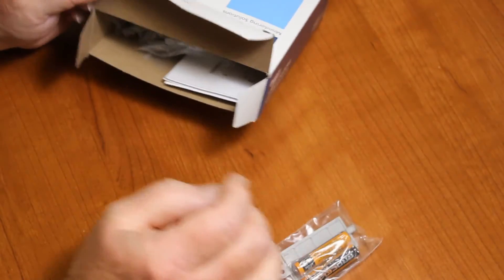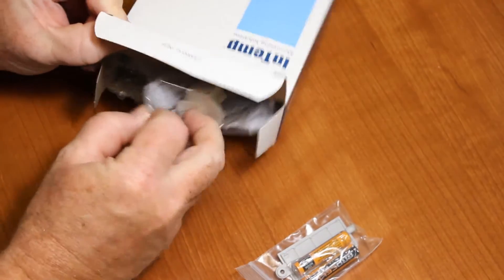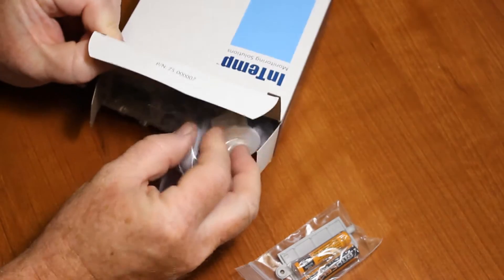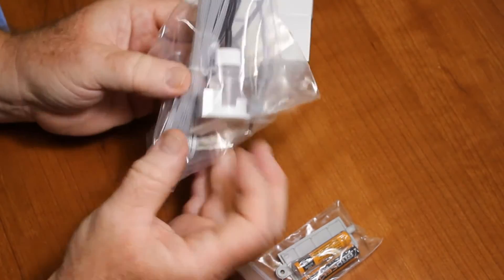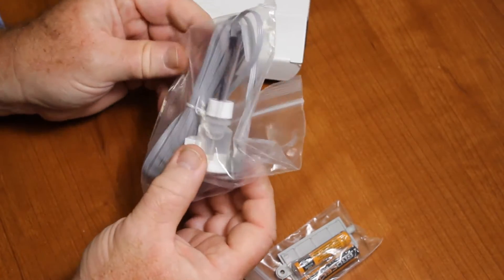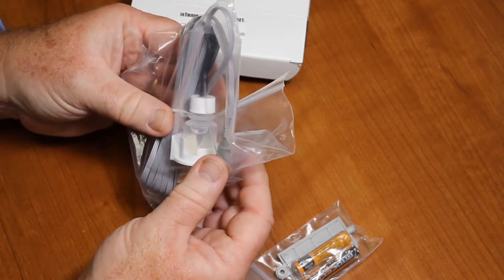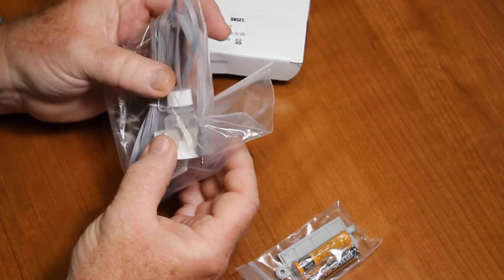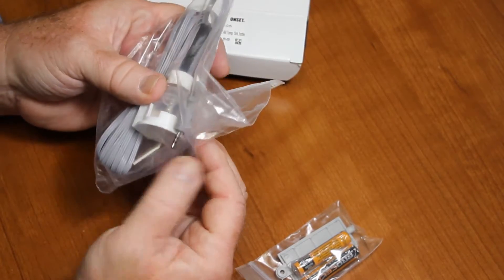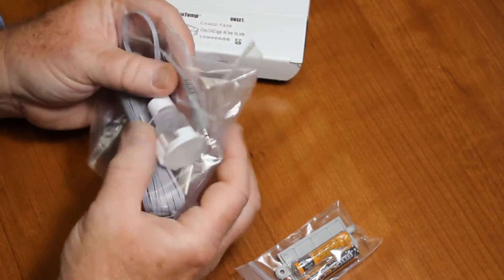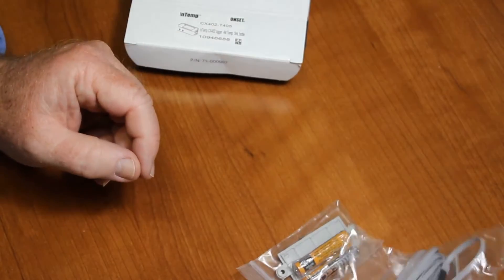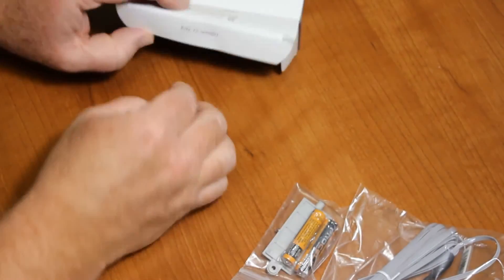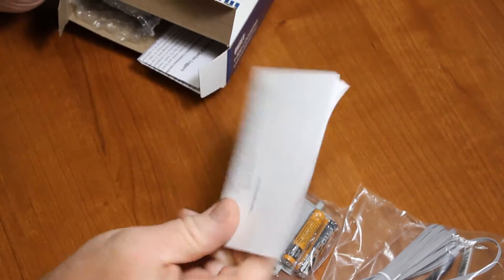This particular logger has the external temperature sensor with a glycol bottle included. This is all assembled. All we have to do is plug that external sensor into the data logger itself.